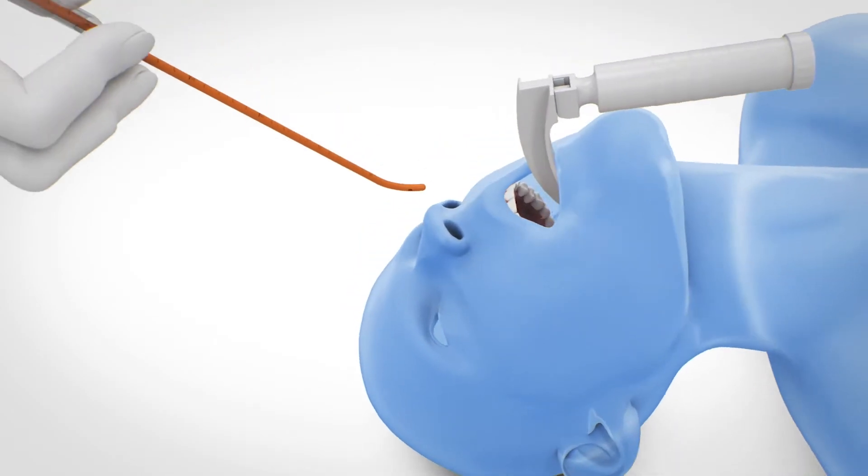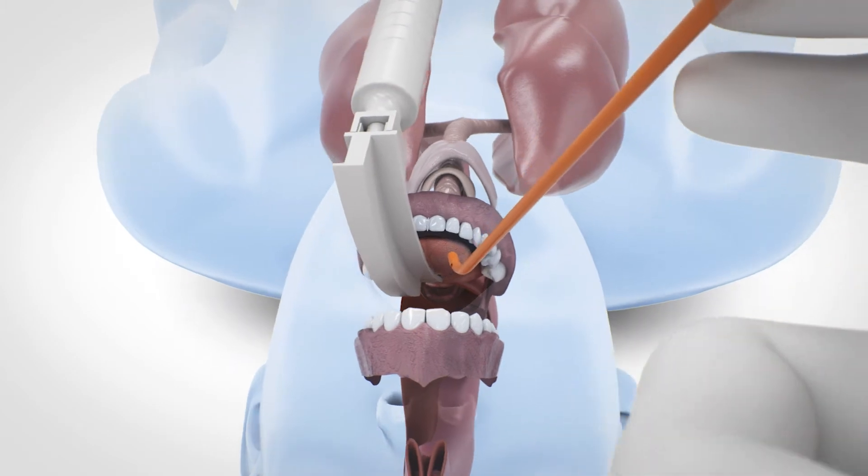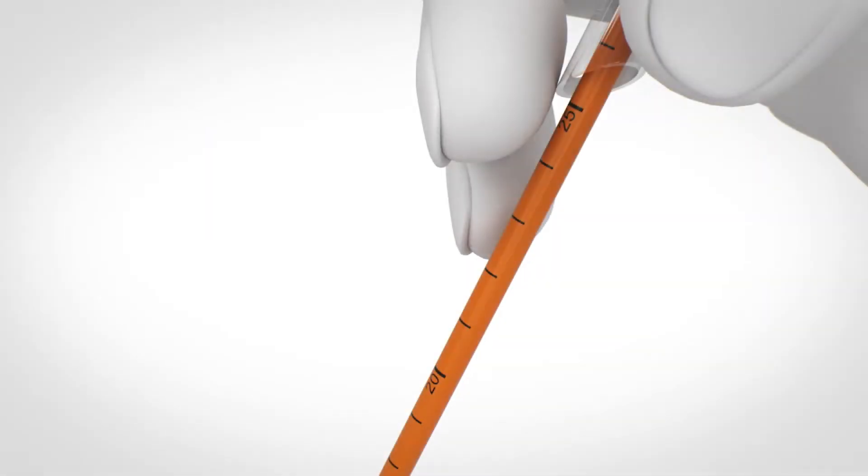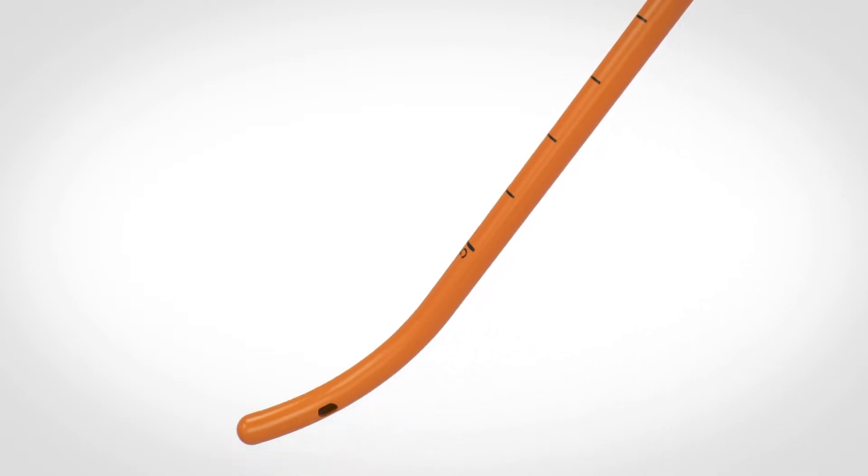Via laryngoscopy, insert the EyeBougie from the side of the mouth with the angled tip first. For clear orientation, make sure that the centimeter markings face up, which provides better control of the angled tip in the vertical plane.